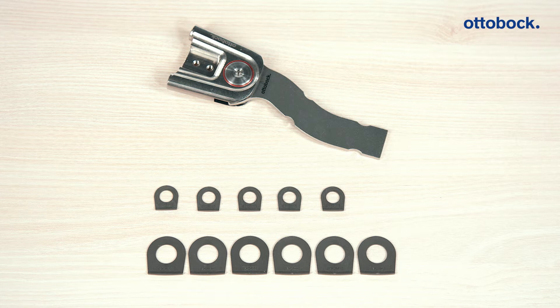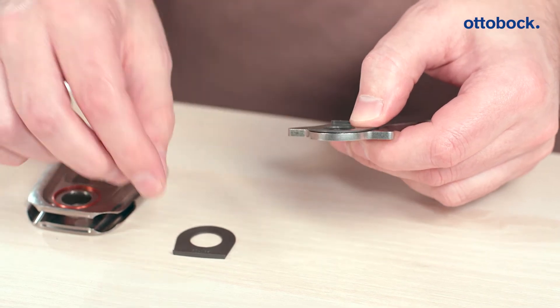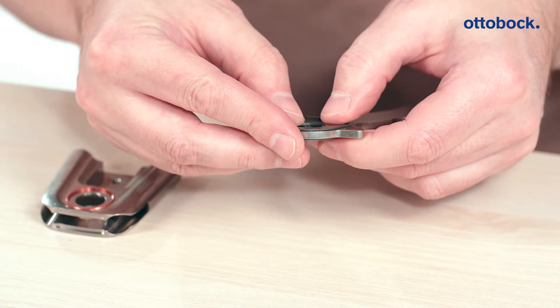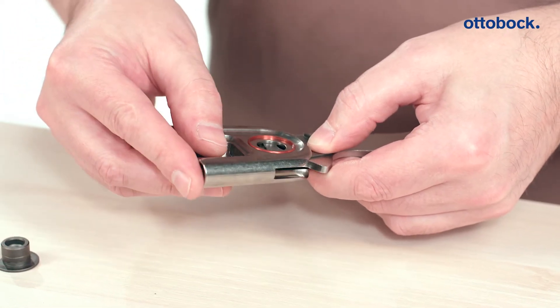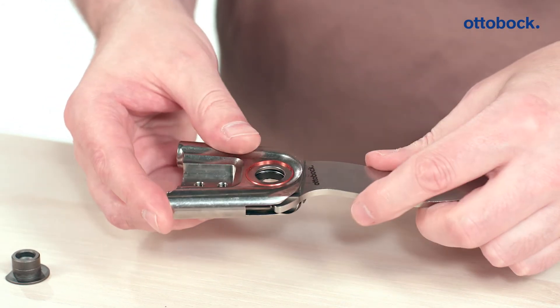For sizes 10 and 12, we recommend starting with two axial washers with a strength of 0.8 millimeters. For sizes 14, 16, and 20, one millimeter. Now simply position the two axial washers on the respective sides of the foot stirrup, with the mechanical stop of the axial washer facing away from the foot stirrup. Then slide the axial washers together with the foot stirrup into the joint.